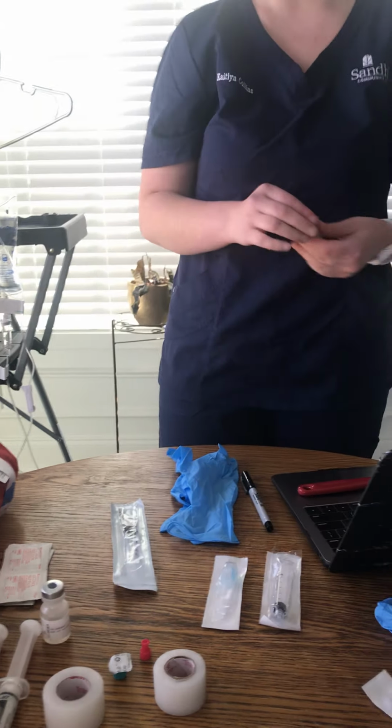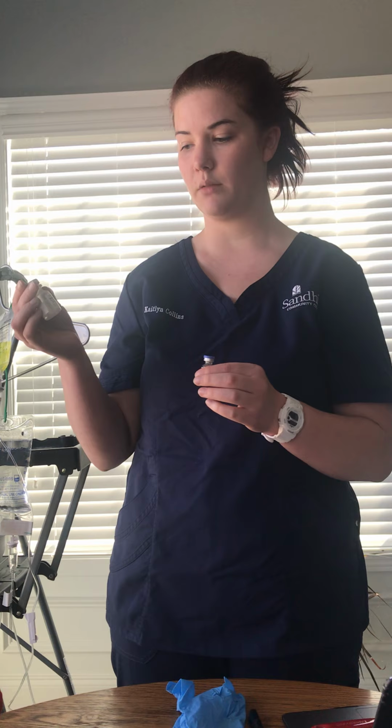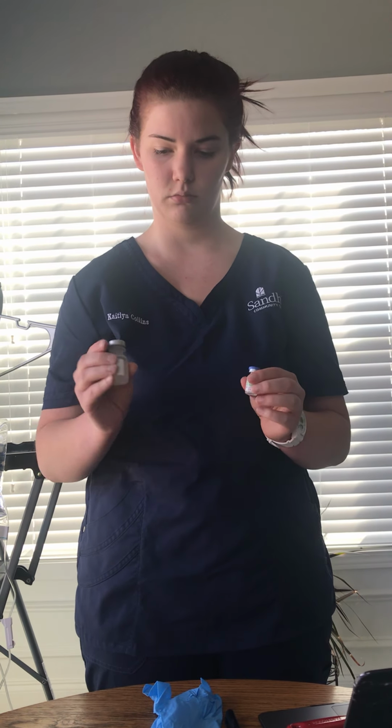All right, so for this we're going to be giving you, Mr. Brown, some lorazepam for your anxiety. And I have checked already with the drug guide and the MAR that it is compatible with the ordered solution of 0.9% sodium chloride here, and it is compatible with everything that's already going into Mr. Brown's IV.